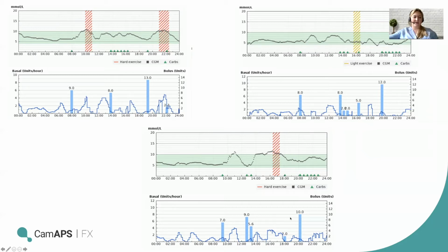If you suddenly wonder, hang on, on the carbohydrate section of each of the day-by-day menus, it shows as if each of them is going in as a 3 gram amount of carbs. It's not necessarily that it is 3 grams of carbs, but that's just how it shows on the system.